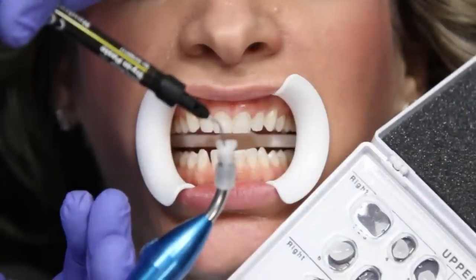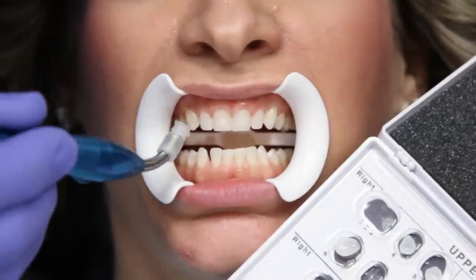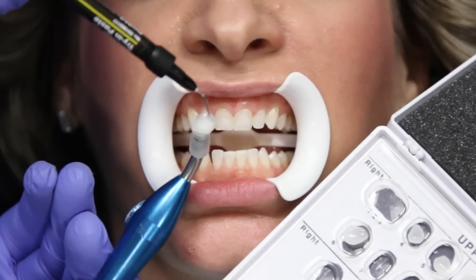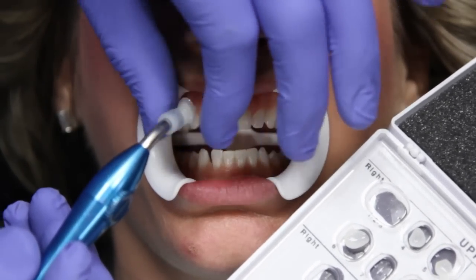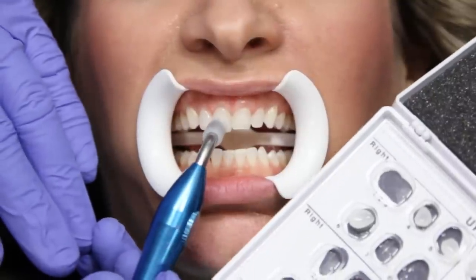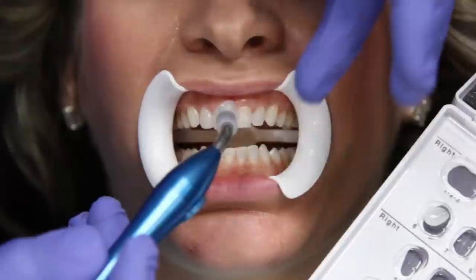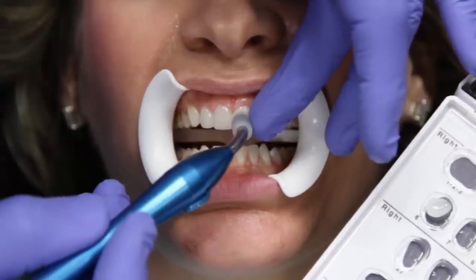Apply the mixture of Ultrabond Plus Try-in Paste and Cerinate Shade Modifier or Opaquer into each of the lumineers. Gently place the lumineers one at a time and use a brush to clean up the excess Ultrabond Plus Try-in Paste. We recommend Denmat's LumiGrip to prevent dropping the lumineers during placement.